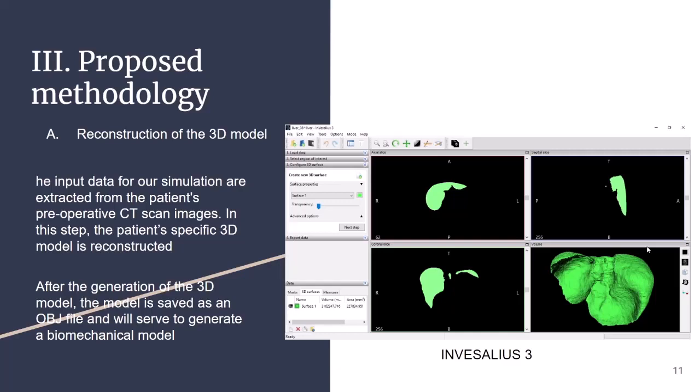Both of these data go into the InVesalius 3 software and will return segmented images of the liver model in our example. After we generate our 3D model, this model will then be saved in OBJ format and will serve as the foundation for creating our 3D biomechanical model.